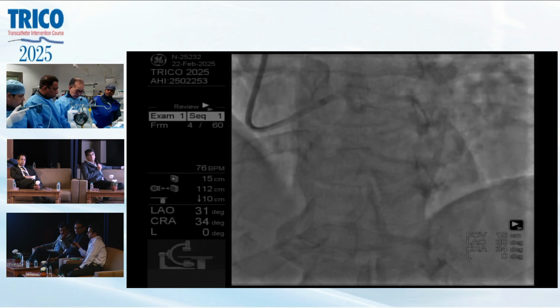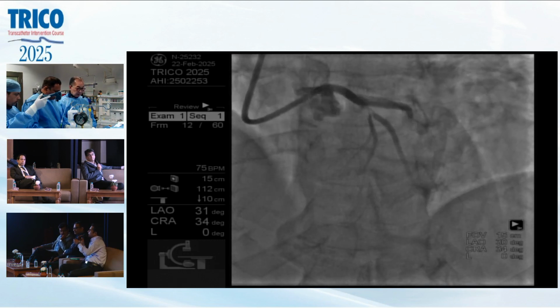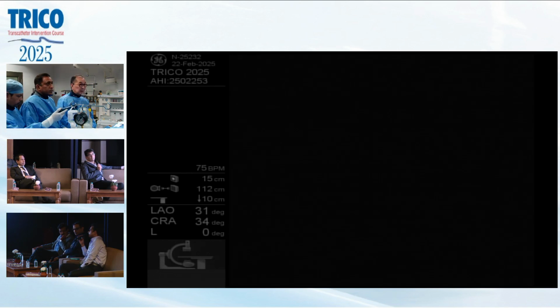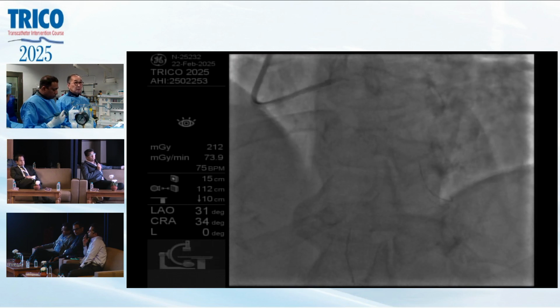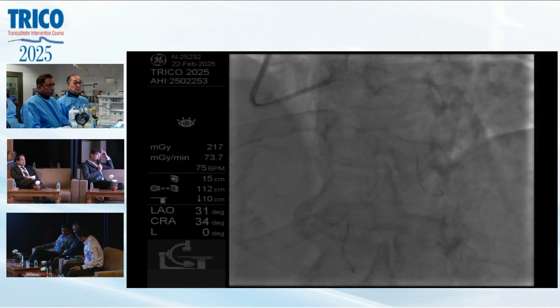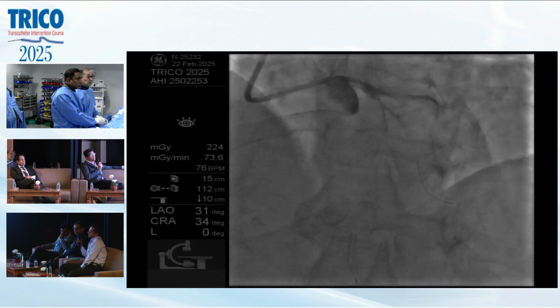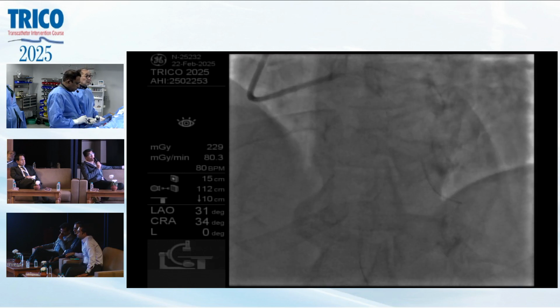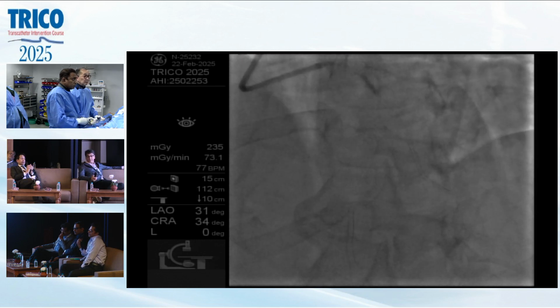The question is, why not keep it provisional? The lesion, even if it is there, is very short and limited to the ostium itself. Why not provisional? I probably lean towards a two-stent technique because of the length of the vessel. Because, as you said, it's a dual LAD kind of system, I would plan a two-stent technique up front.